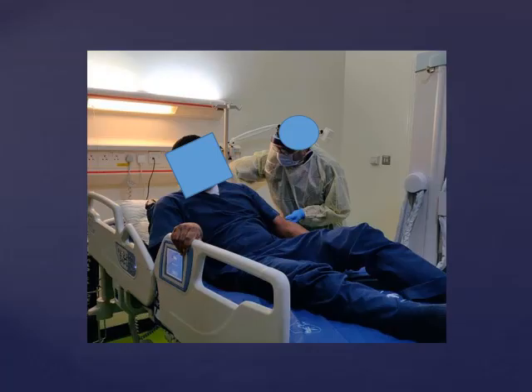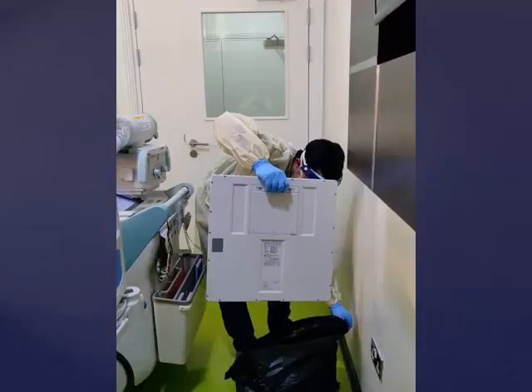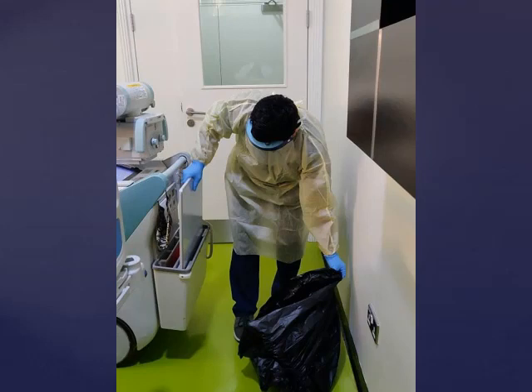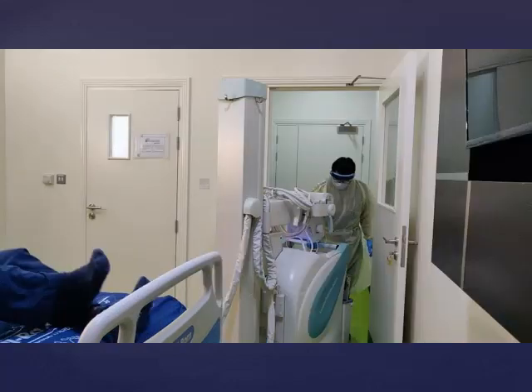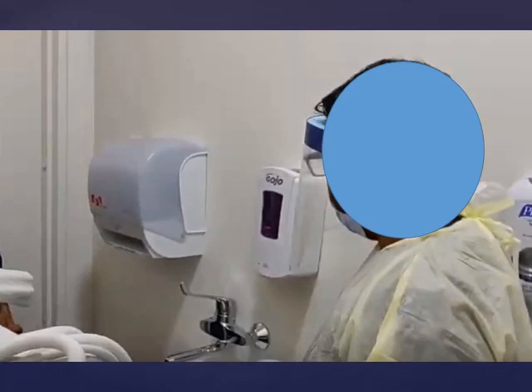Take the detector from behind the patient, place it on the floor, and sanitize your gloved hands. Then remove the detector from the plastic sleeve and place it back into the portable machine. Take the bin bag and dispose of it into the clinical waste bin, and sanitize your gloved hands again. Now move the portable machine into the anteroom, where you can proceed to clean and disinfect the detector and the machine using chlorine wipes or bleach wipes, or check with your vendor for the recommended disinfectant.